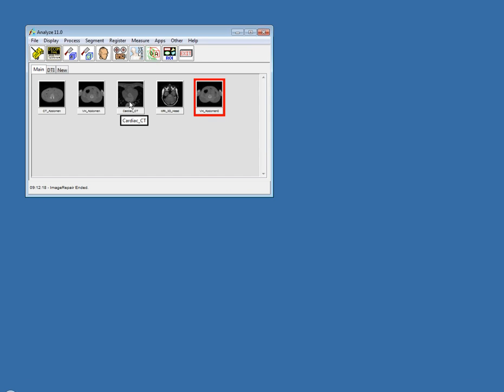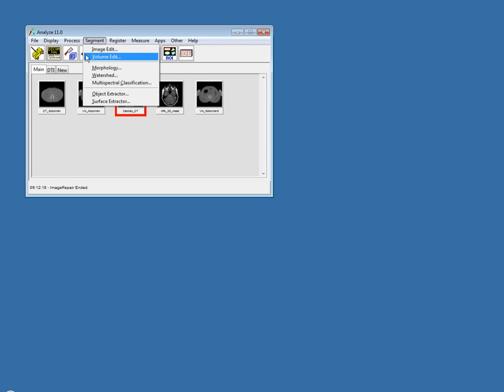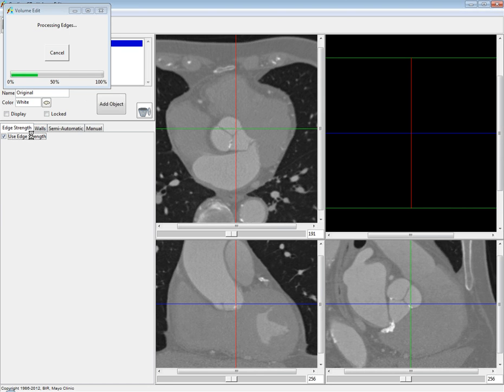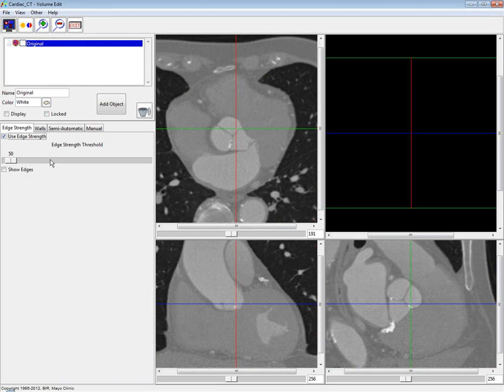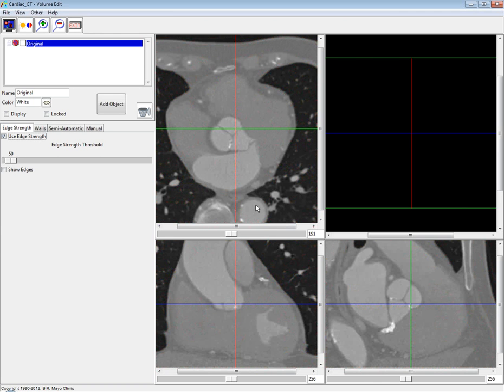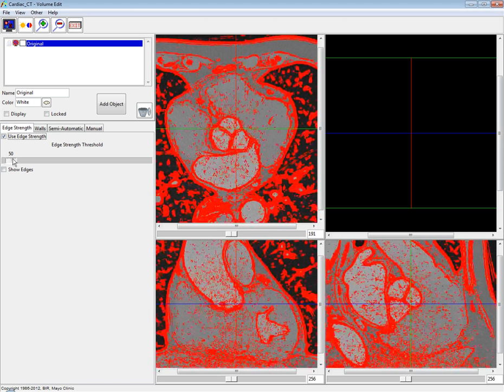Next I'm going to move into the Volume Edit module. Volume Edit is a module added in Analyze 10.0 and it's continuing to evolve — it can really streamline your segmentation tasks. Analyze 11.0 continues that evolution with useful new features. The first is underneath the edge strength tab. If you check use edge strength, it calculates the edges. In Analyze 10.0, you viewed edges by pressing the edge strength threshold button, which gave a binary display. Now you can already see those red outlines in place of the binary image.